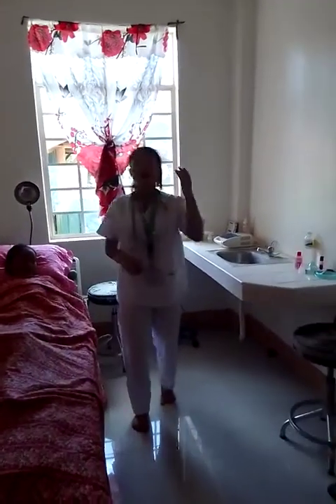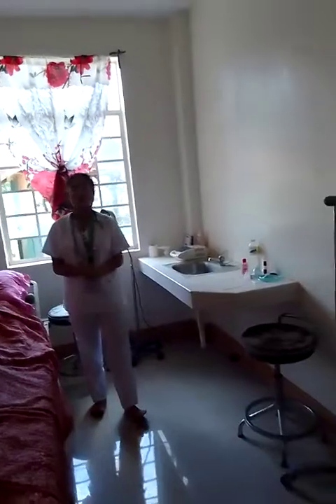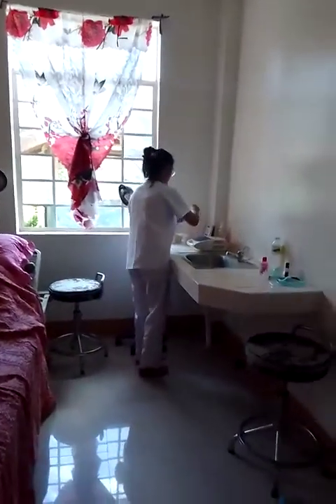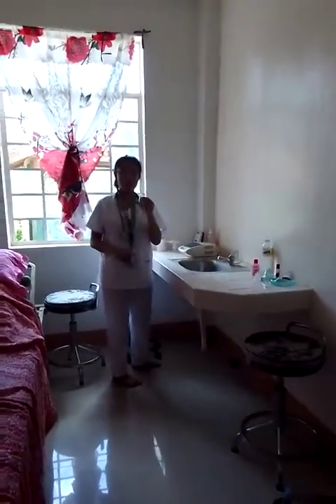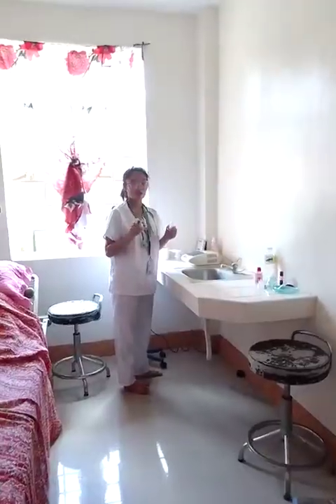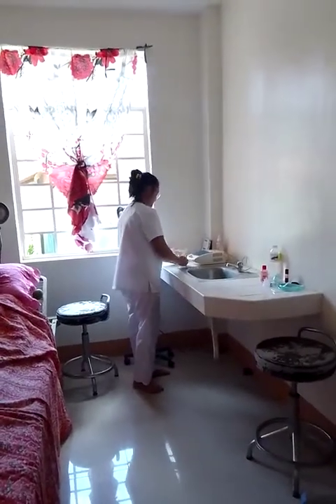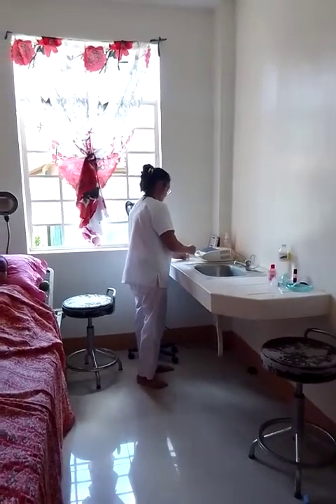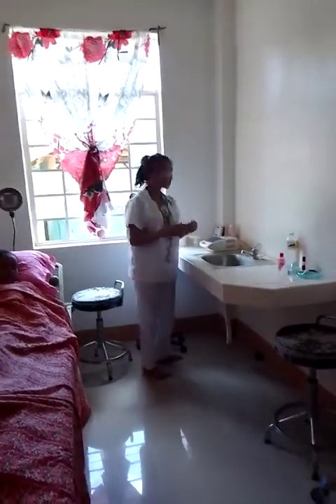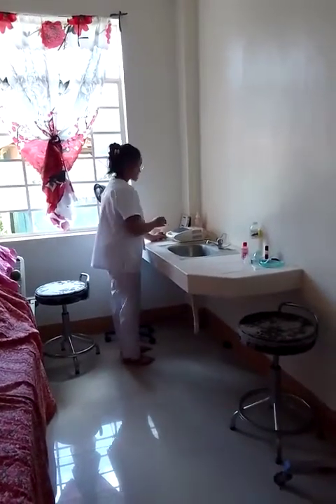Okay. The next step that we need to do is add the prescribed amount of medication in the nebulizer cup. Now we put the medicine amount in the cup here. We need the cup because this is where we put the medication. And then after that, we assemble or connect the parts.